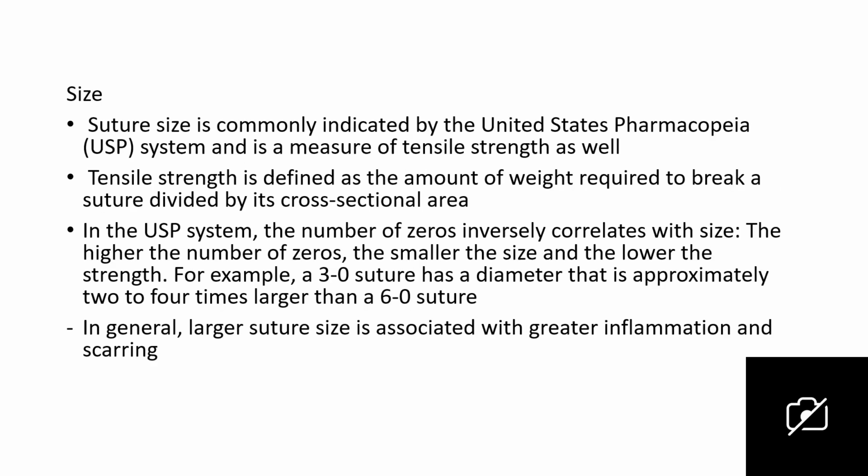Okay, now the size. Suture size is commonly indicated by the United States Pharmacopeia (USP) system and is a measure of the tensile strength as well.